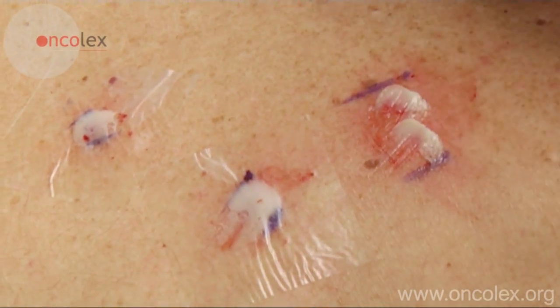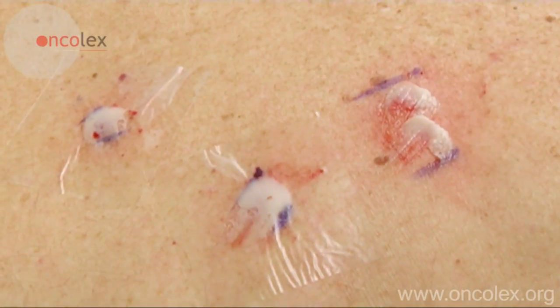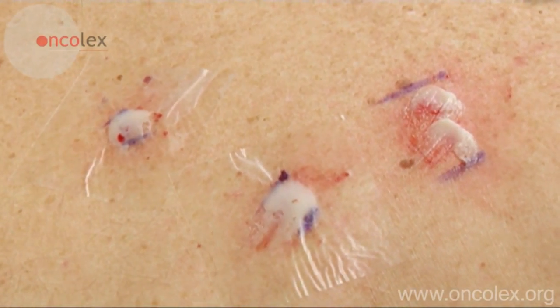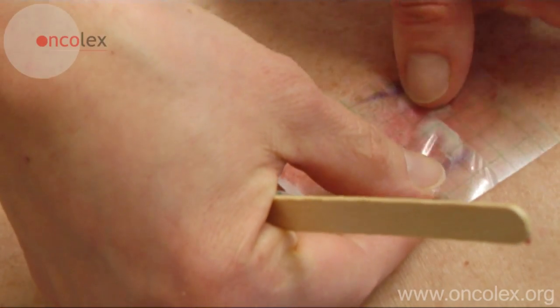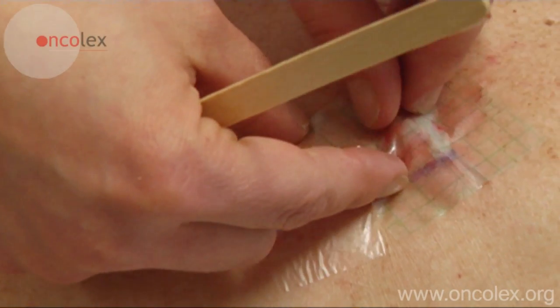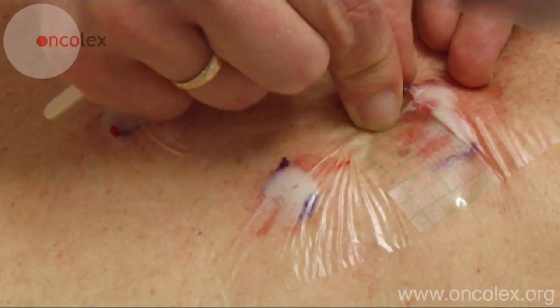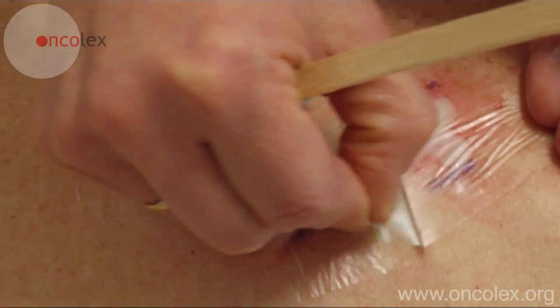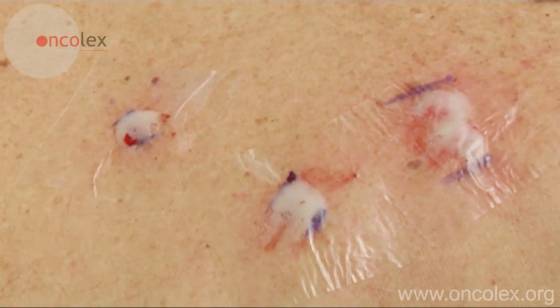After scraping, the cream is applied to the lesions. This will now be absorbed effectively by the tumor cells. The active ingredient of the cream makes the cells sensitive to red light. The cream is allowed to work for three hours before the light treatment.